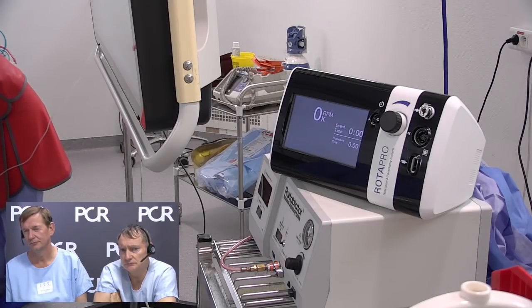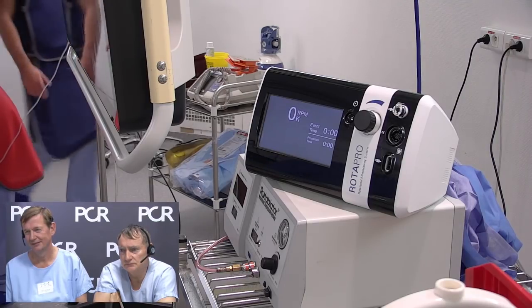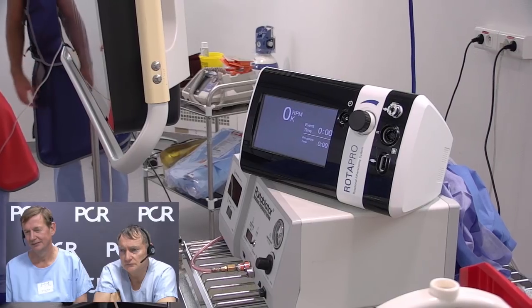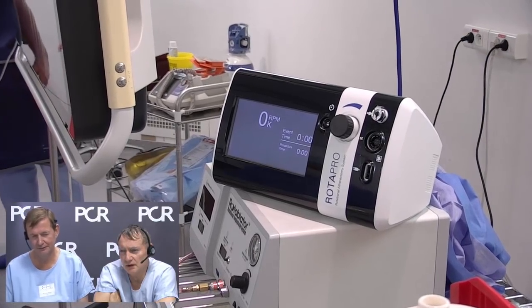The first rotablator was done 30 years ago. It took some time, but we have a new version now. The old one was black and white, and you will see while doing the procedure that there is lots of information that we can collect with the new system. So we are provided with interesting feedback, but let's prepare the system together as we go.